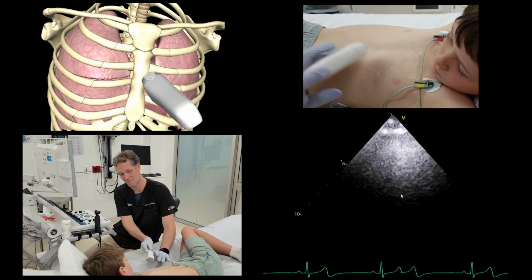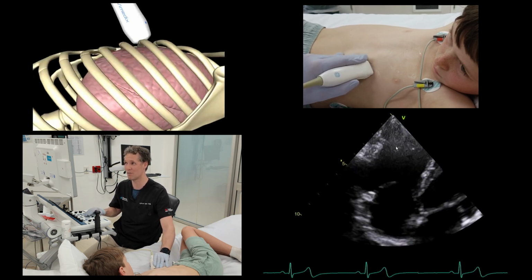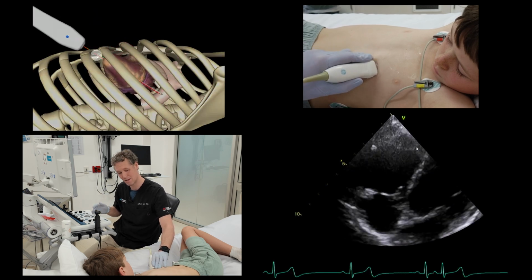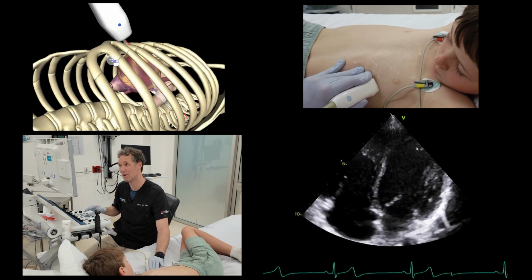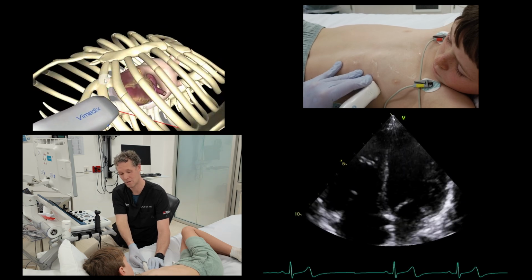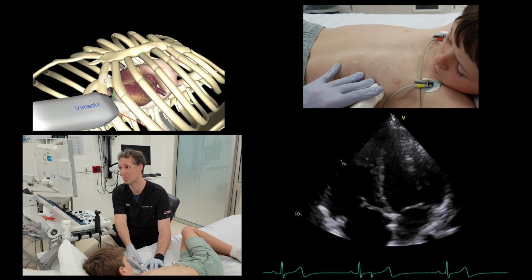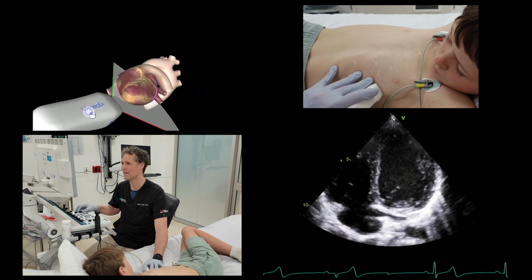Apical views, marker down towards the patient. You don't want to sit too medial because you're sitting right over the right ventricle. I want that interventricular septum right down the middle of the screen. So I'm going to try and follow that rib space round until that interventricular septum is pointing towards the apex. I can then fishtail, and you see how that interventricular septum then points towards the true apex. And now I can turn up the depth.